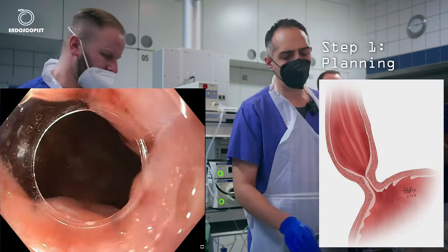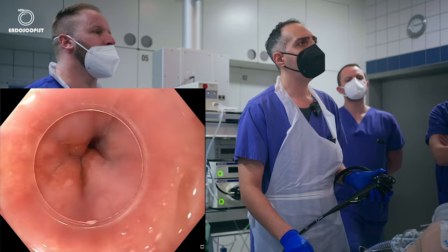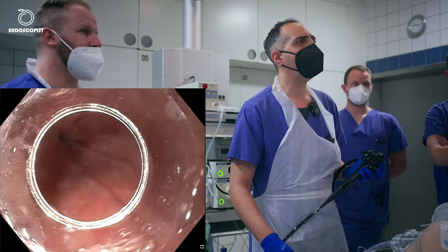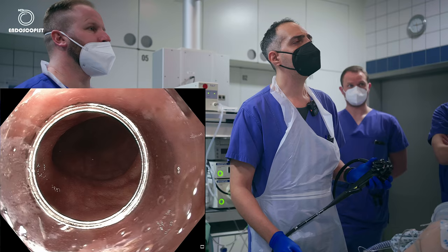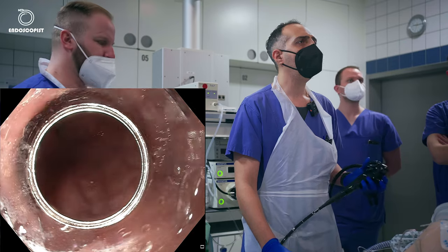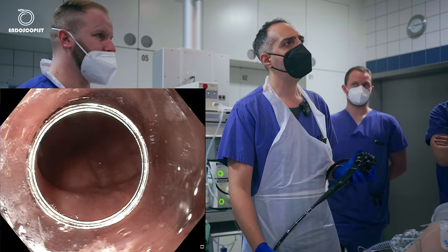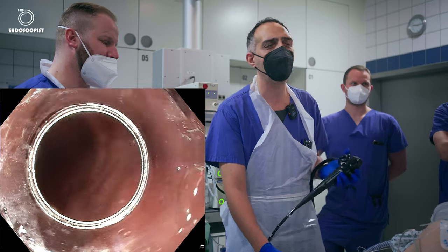It's very important to see where the cardia is. It is by about 40 centimeters. And we have something like 3 centimeters spastic area. And now I'm planning to see where we will start. So in this case, I usually will do something like 8 centimeters myotomy. And you need 5 centimeters above the myotomy in the tunnel, which we will leave the muscle intact. So 5 plus 8 will be 13. 13 minus 40 will be 27.